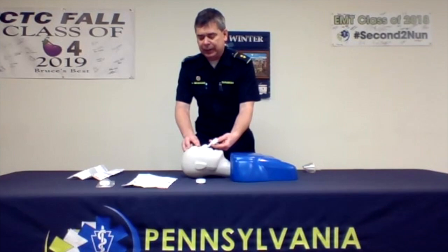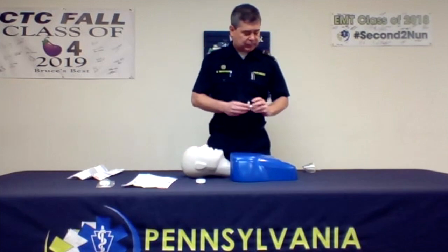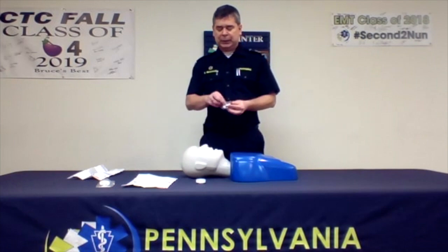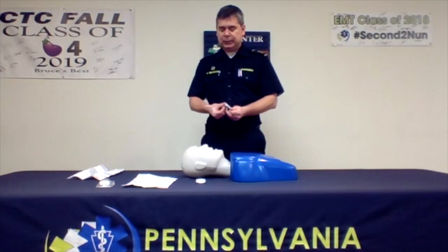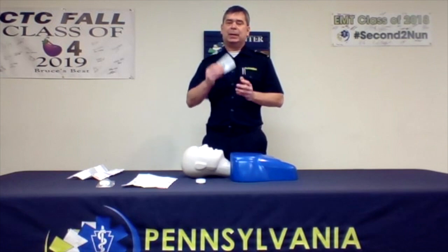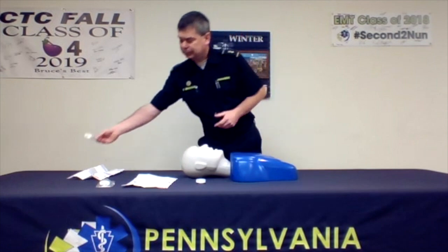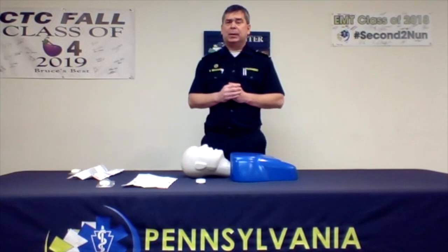Depress the nasal Narcan sprayer and discard the Narcan. Place it back in its package, and it can be deposited in your trash safely. Ensure that children do not have access to this when you are complete with it.